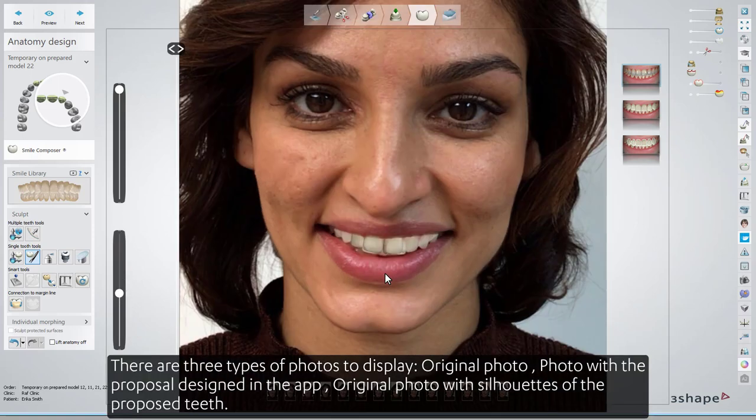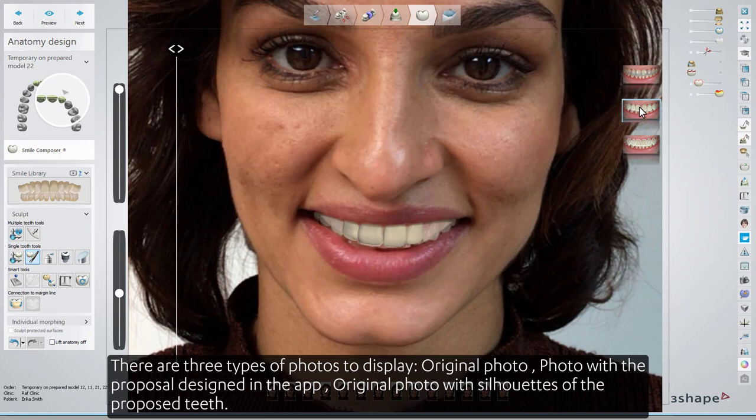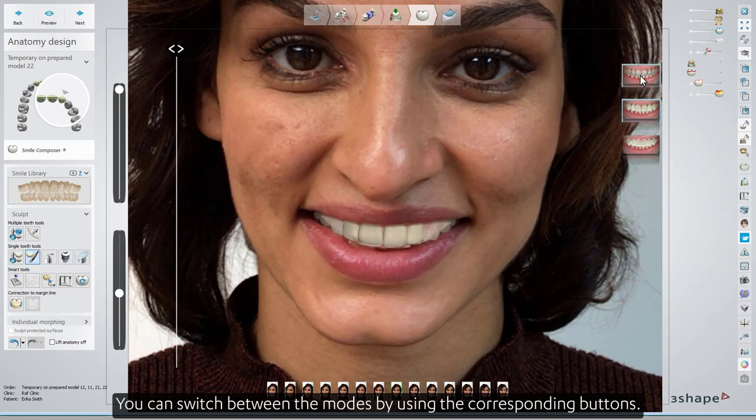There are three types of photos to display: original photo, photo with a proposal designed in the app, and original photo with silhouettes of the proposed teeth. You can switch between the modes by using the corresponding buttons.